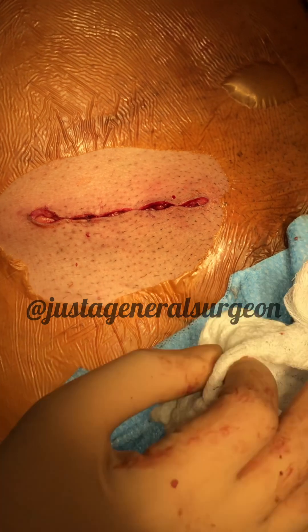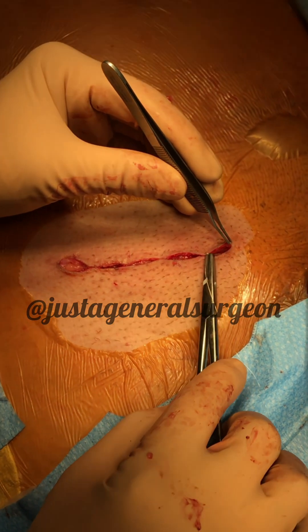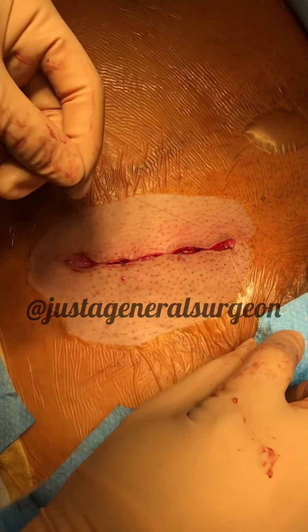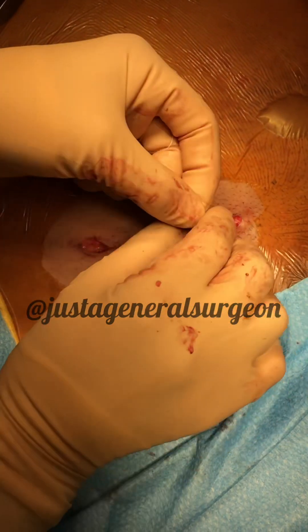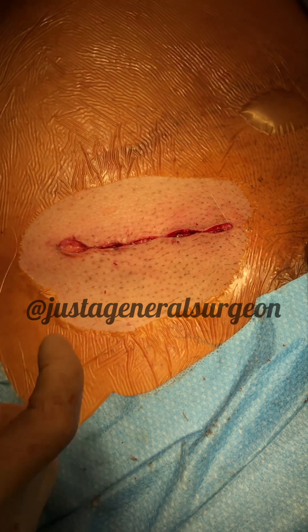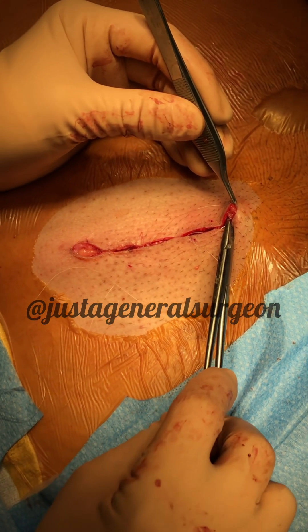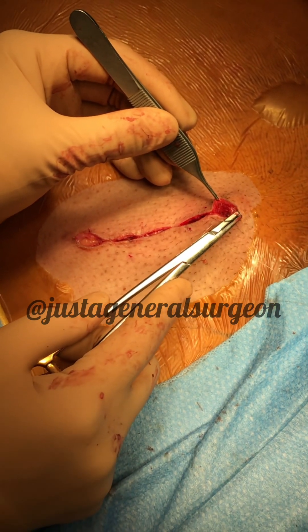Now we're going to do the subcuticular closure. The way I like to start is at the corner with a backhanded needle, going deep to superficial right at the corner. This is a 4-0 Monocryl I'm using. I'm going to tie it down, then cut one end right at the knot without the needle. Then deep to superficial again to dunk the knot, going right at the dermal-epidermal junction starting at the corner.